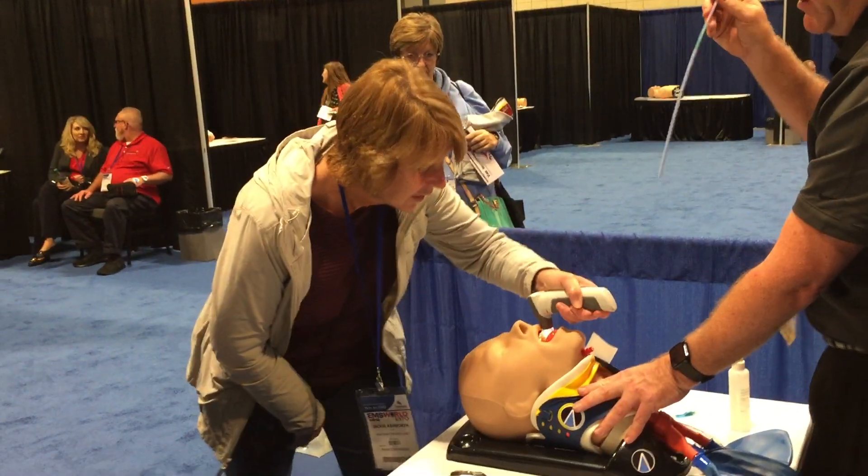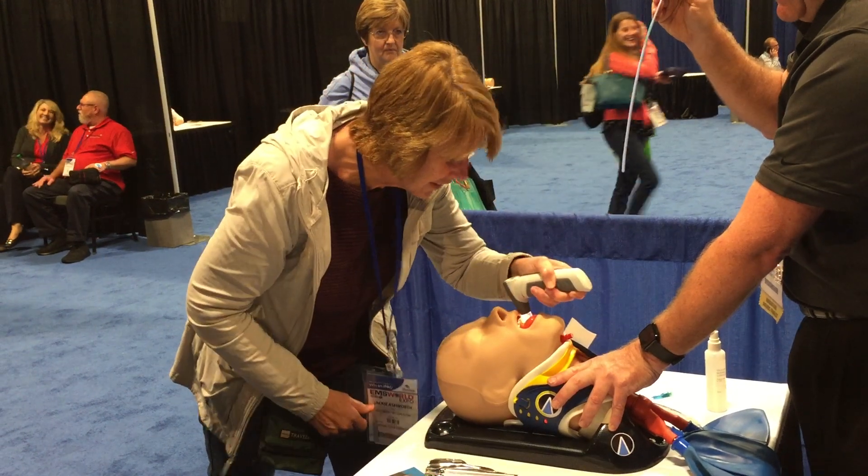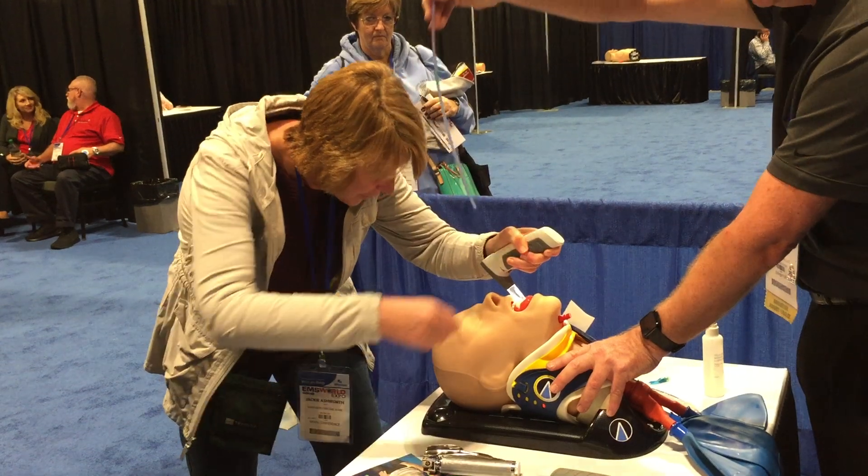When you see the cords, call it and then I'll pass it through. I'm so used to looking around. But I've pumped up the tongue — it's a swollen anterior.